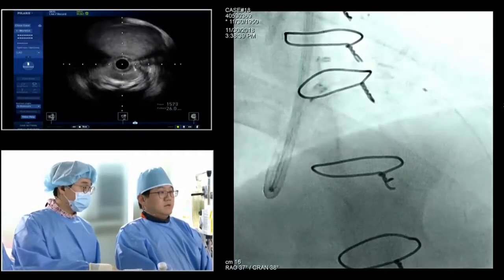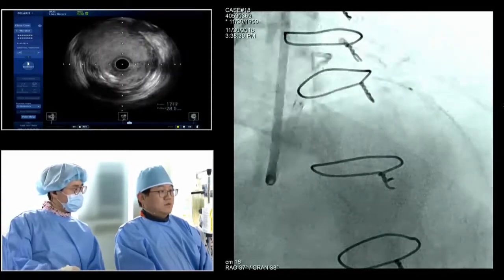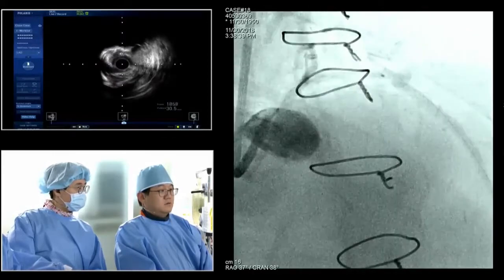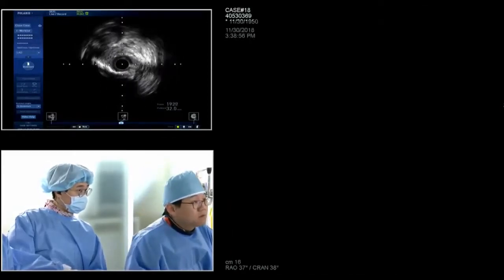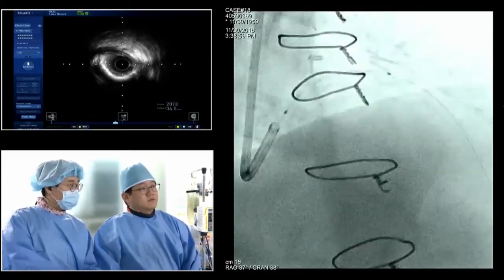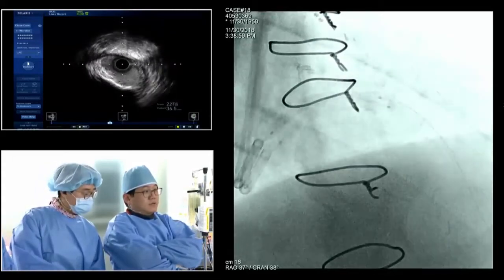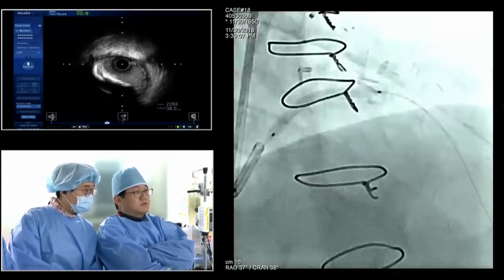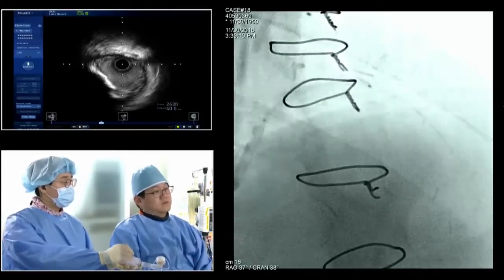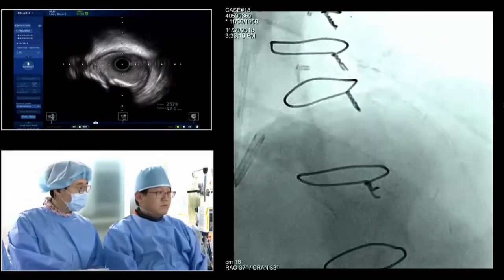I can measure the length. Test, please. Okay, more than 30. Test. Okay, why don't you pre-dilate? Yes, to check if it is really dilatable or not. 10, 10, 12, 13, 14, 14. Good. Okay, deflation. Is there 3.5? 4.0 by 35? Okay, 4.0 by 35.